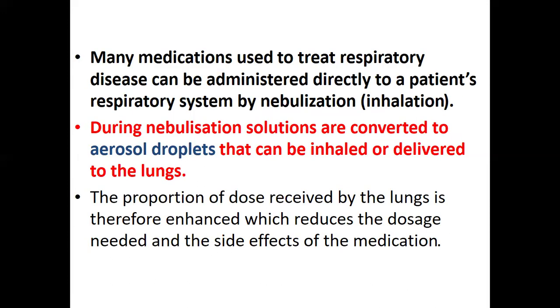Many medications used to treat respiratory diseases can be administered directly into the patient's respiratory system by nebulization, which could also be referred to as inhalation. During nebulization, solutions are converted into aerosol droplets that can be inhaled or delivered into the lung. The proportion of the medication received by the lung is therefore enhanced, which reduces the dosage needed and the side effects of that medication.